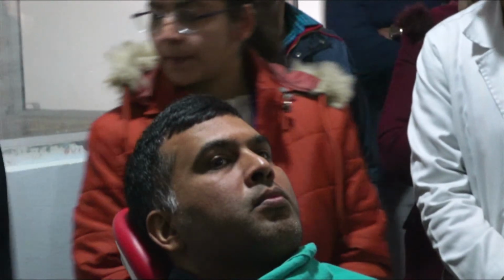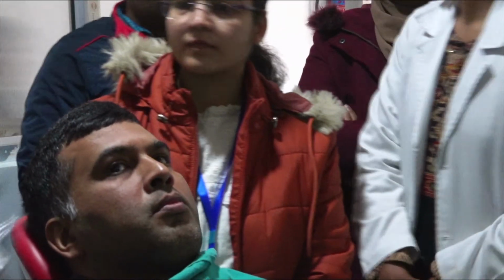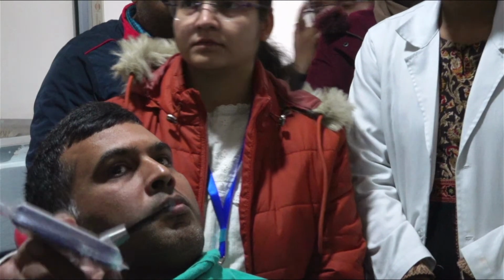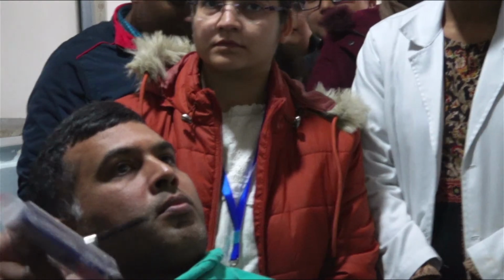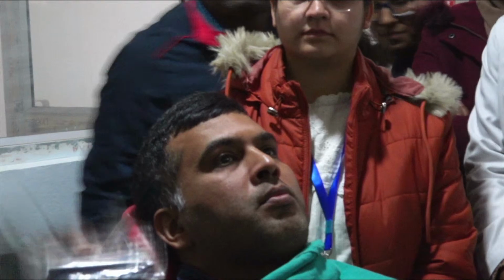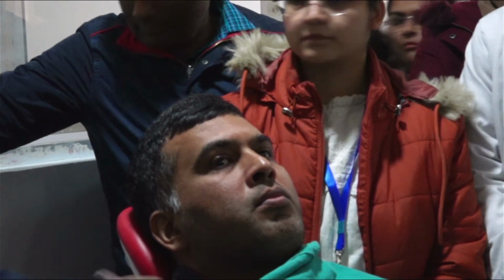Can you see this red button? On the red it is written 640 nanometer. Sometimes if you have only one dye, no blue, you don't have this. So then you can press the red button, 640 nanometers, because it is the methylene blue, right? And you can use this. The biological effect will be same. The results will be same. It depends on what you have at your discretion at that given period of time.